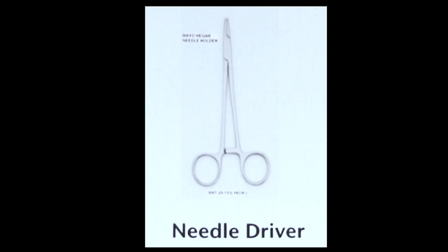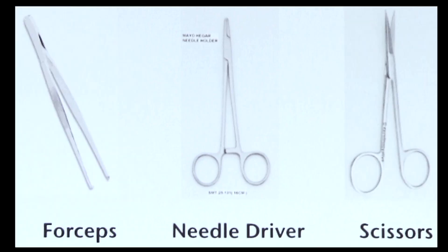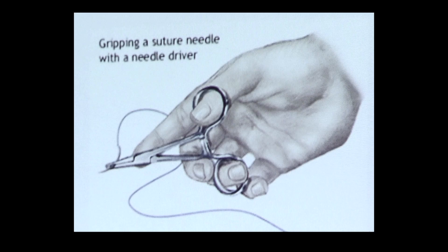Next, you'll want what's called a needle driver. You can use tweezers or something else — it's just a lot easier to be precise if you have something to hold your needle besides your grubby hands.